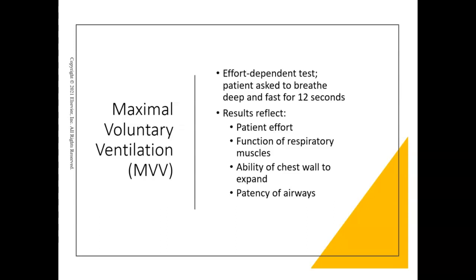This test is looking at airway patency and at respiratory muscles, their ability to expand and contract. It's also looking for any hyperinflation or gas trapping in this maneuver.